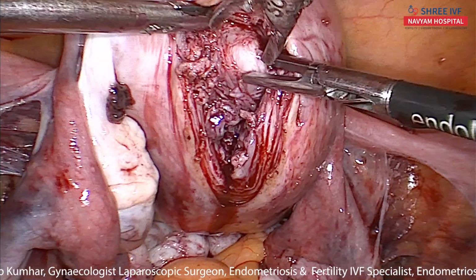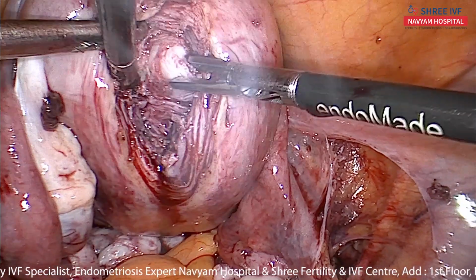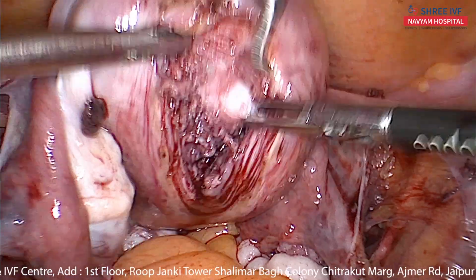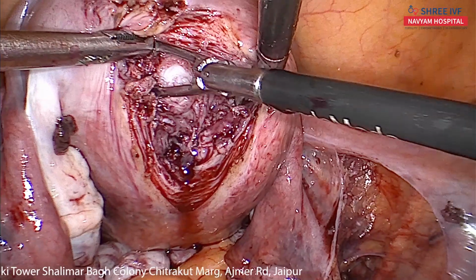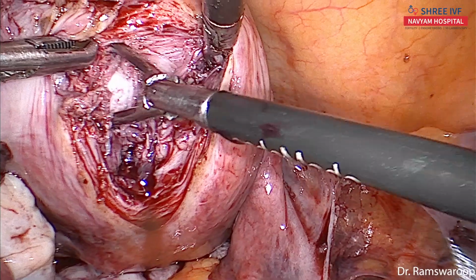Actually, I have not reached the proper plane for this myoma, so this is not coming out. So I have to dissect it well, by blunt as well as sharp dissection. And oh, this is very deep here.